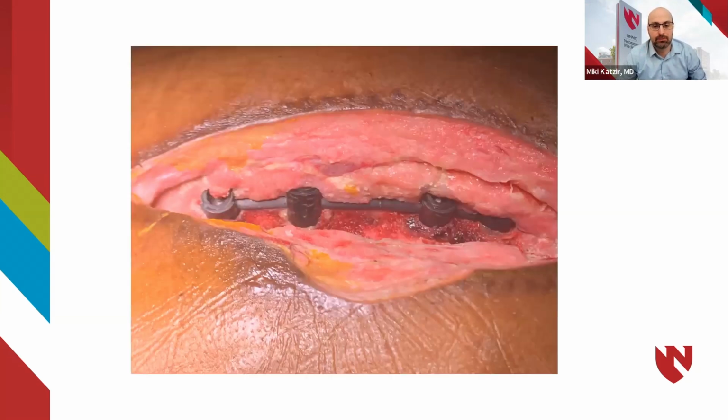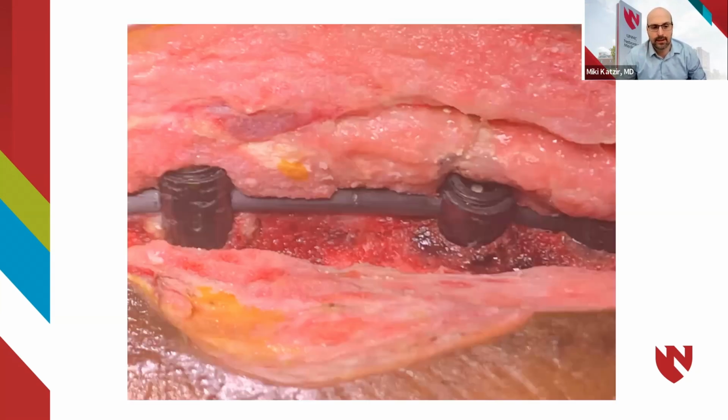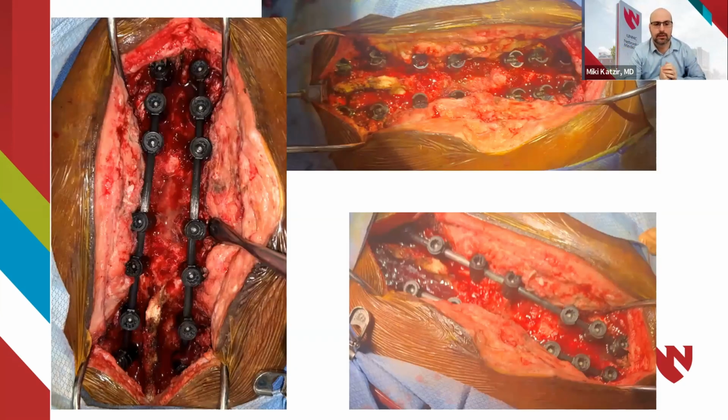and I had to open him up. From the infection, the set screws got loose. And again, the first time it happened to me, but I actually didn't know what to do. I treated it as any other infection. I removed the screws, replaced the rods, replaced the set screws, replaced the screws themselves, and then because there was some lucencies around the screws, I extended the construct up and down a couple of levels, and this is the final construct. And I heard from the companies that this is I think the longest construct in the country for carbon fiber. And this is how it looks.